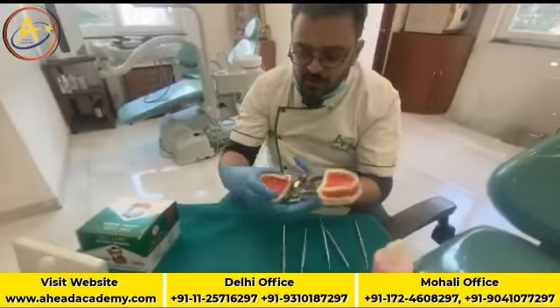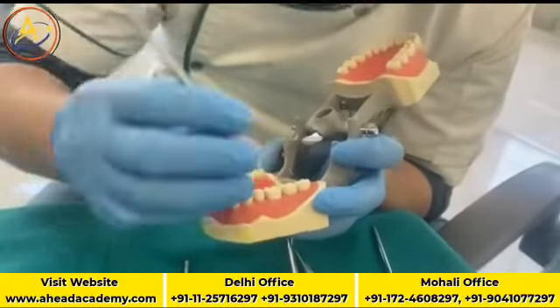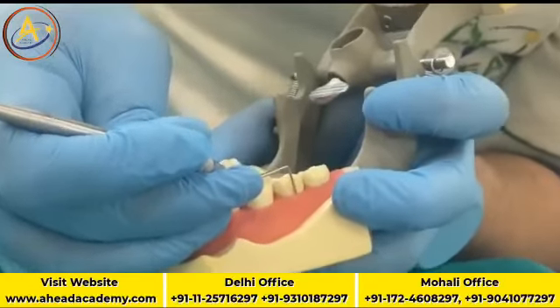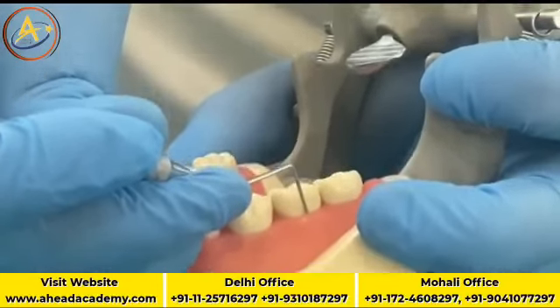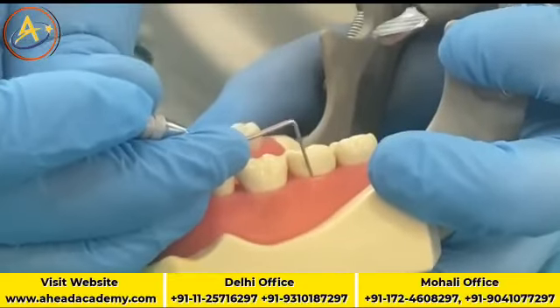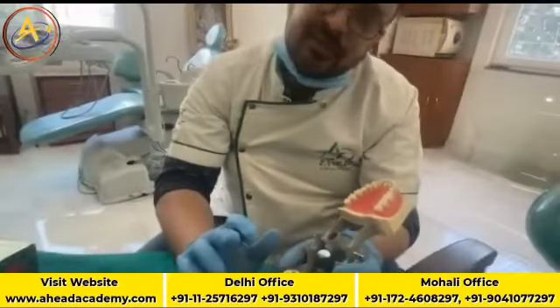If I can show you inside the video, if I put a probe here, just an example, so this goes inside straight and here it stops. So the space between the CEJ and the bone where the probe is going is called the normal probing depth. And what is the space inside called? The space inside is called the crevice. Earlier it was called sulcus, now it is called crevice.